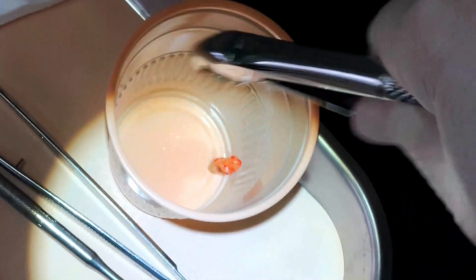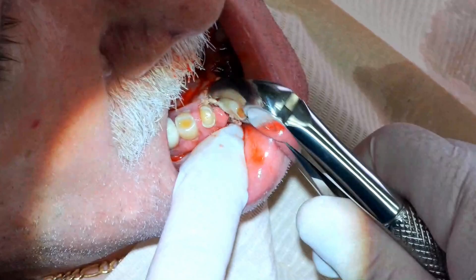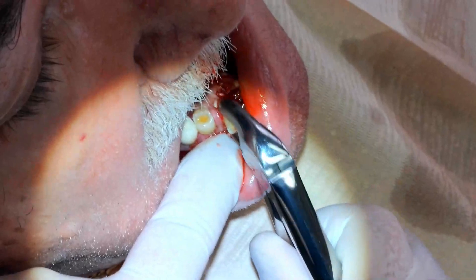So it's a short, sweet video. I'm just going to use my ash forceps and grab the teeth one by one, work them back and forth and pop them out. Now we've got one tooth left — let's remove that one and drop it in the cup.